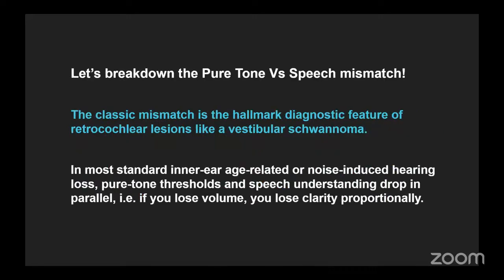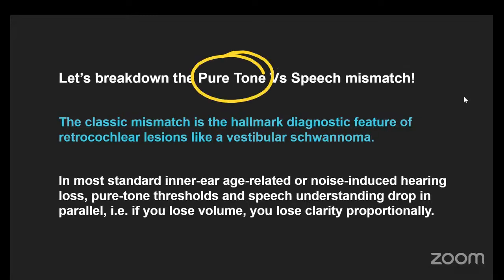Now, let's break down the pure tone versus speech mismatch. What do I mean when I say pure tone audiometry? There is going to be a single beep, instead of a barrage of sounds, a single beep at different frequencies.